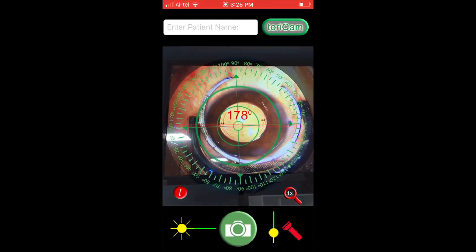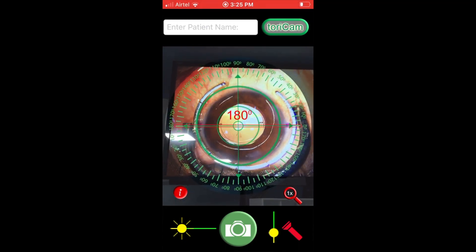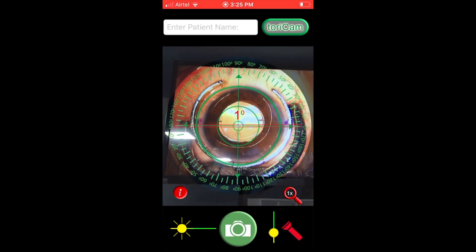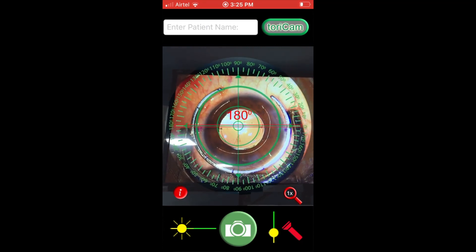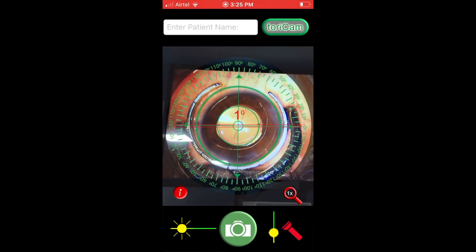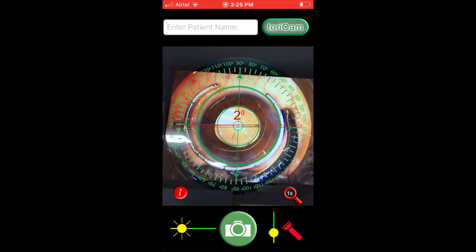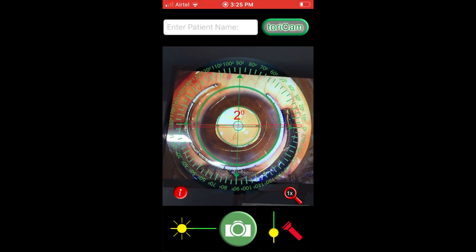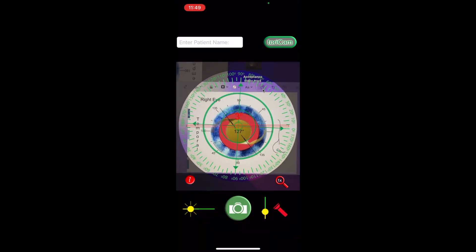A fixation ring might also help because it allows us to understand whether the reflexes from the anterior and posterior IOL surfaces are exactly aligned, but one has to be careful because it can also induce some cyclotorsion.